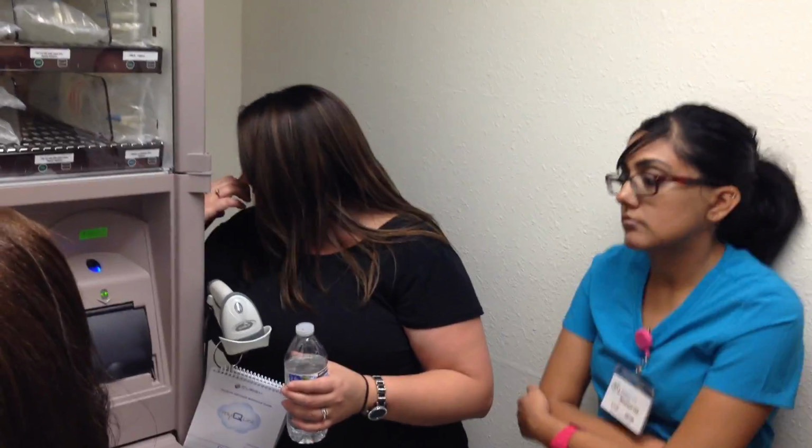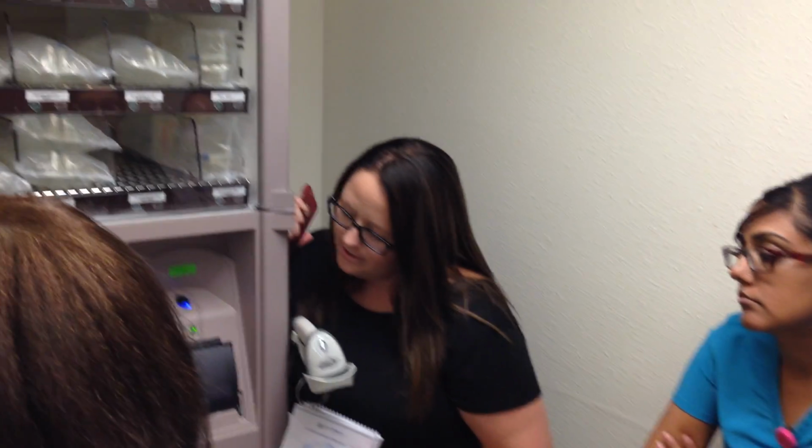Same process, all right? If someone tells you to go ahead and complete an override, what they're really trying to tell you is to go ahead and add the items, okay? The verbiage on the button is add items, so we're trying to get the people in the pharmacies to start saying add items because that makes more sense to you guys, because that's what you see, right? So go ahead and hit add items.